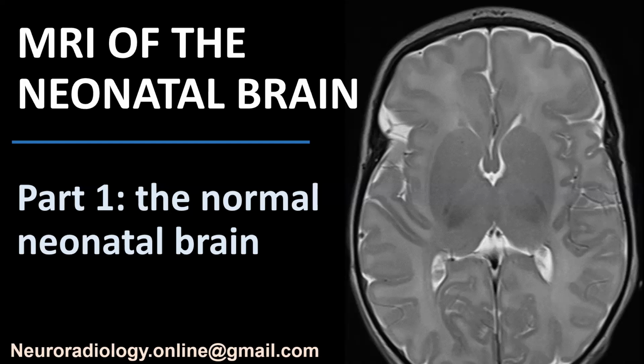Today, I'm going to talk about MRI of the neonatal brain. This is going to be the first of several sessions, and today I'm going to talk about the normal neonatal brain. And why is this an important topic? Because the brains of a newborn child look completely different from those of adult patients.